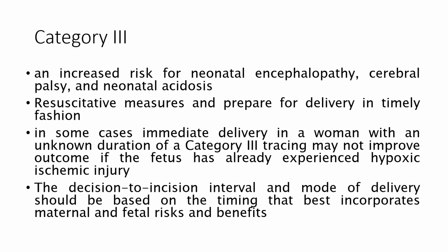In category 3, there is an increased risk of neonatal encephalopathy, cerebral palsy, and neonatal acidosis. What we usually do is resuscitative measures, which include maternal positioning, stopping any medication that we think contributes to the problem, oxygen, examination of the patient, and preparing for delivery in a timely fashion.